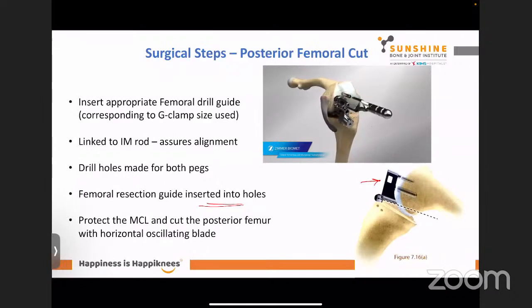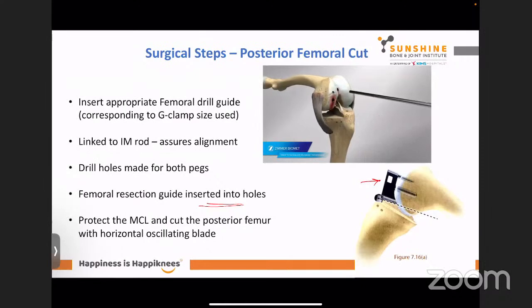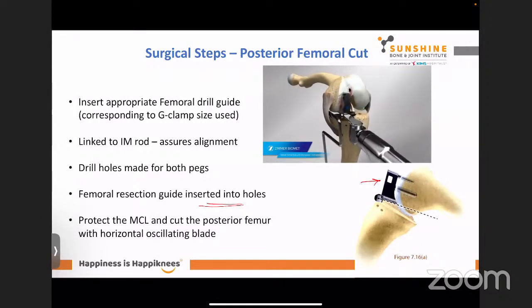Okay, and then you take these out. You take out this femoral drill guide, you insert your femoral resection guide with two pegs, protect your MCL. And then you take your posterior femoral cut. You have to make sure that you're not skiving off the cartilage or the sclerotic bone. Take a nice cut.